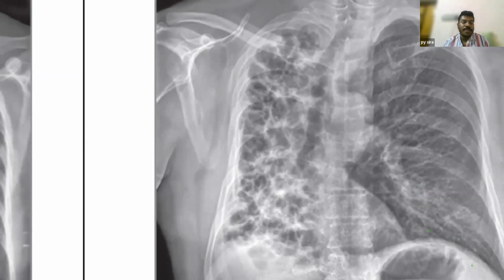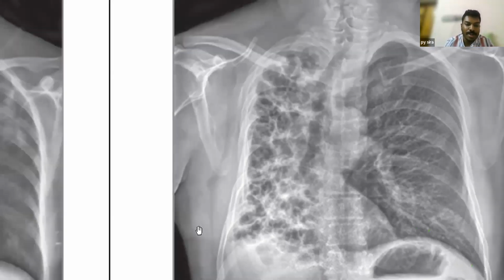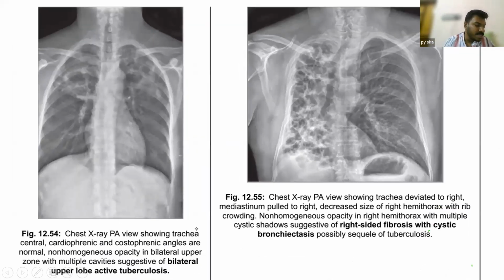So these are a few things about X-ray which I feel are very, very important for you to understand and know. Again, you can anytime come back to me for any doubt about the X-rays. Okay, these are a few X-rays which are kept in medicine. Pediatrics is different, surgery is different. But in medicine, these are the few which will be kept for you for definite. We will see how to go about with these things in exam. So study well. We will meet again in the next session.